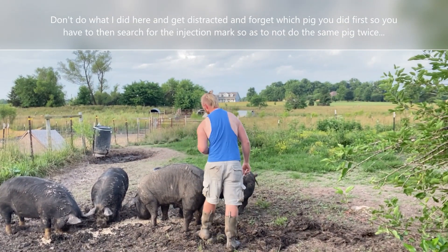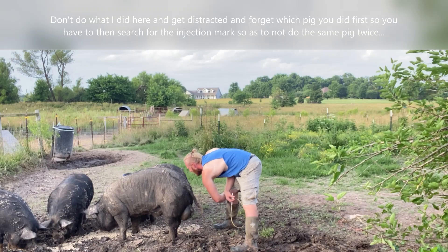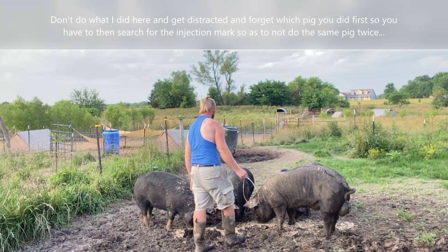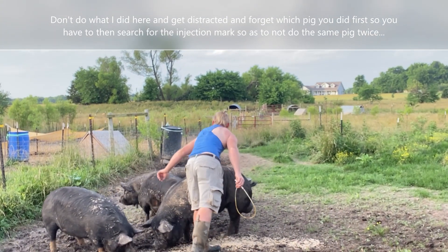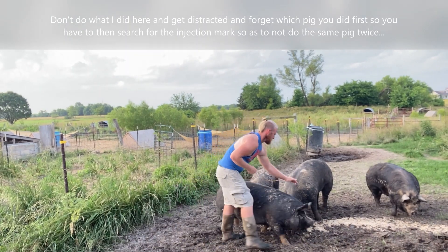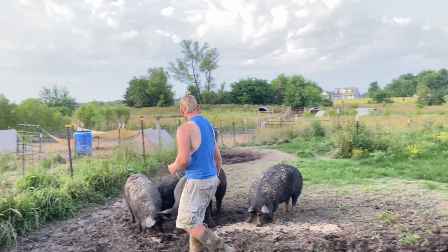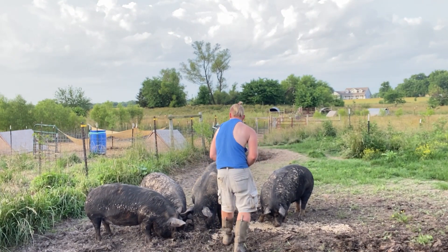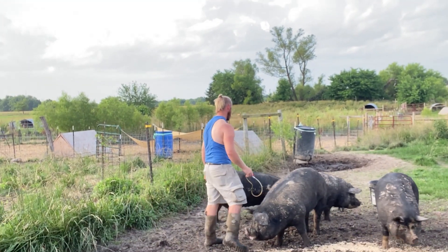Trying to get the next pig cooperating — lots of wrangling to get her into position for the injection. We'll be right back.